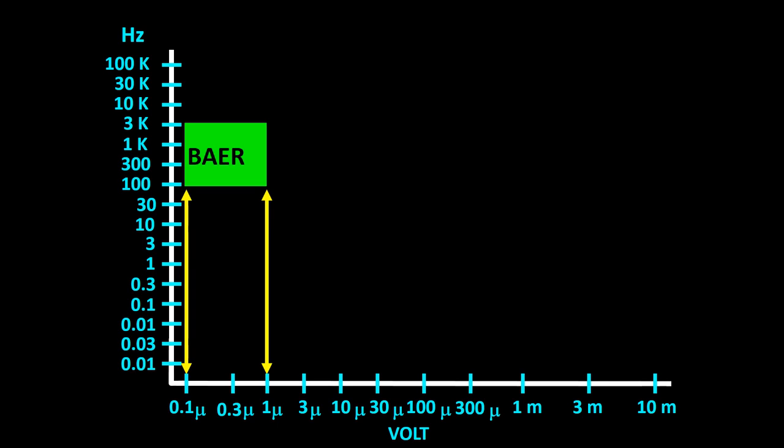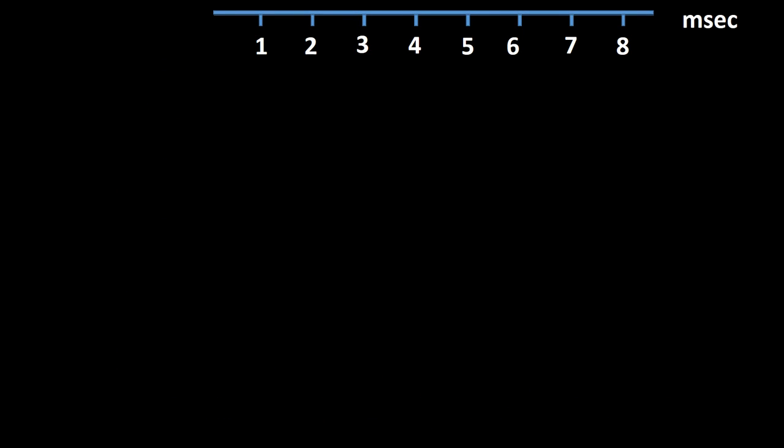In most patients, brain auditory evoked responses are less than 1 microvolt, more in the range of 0.6 microvolts. For this example, I have used a very short duration of recording to show things better, but remember that it is best always to collect information for about 10 to 15 milliseconds after the stimulus.